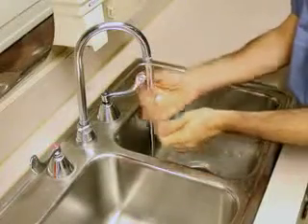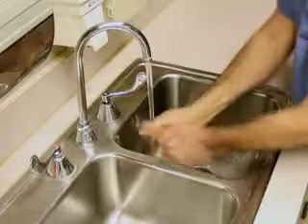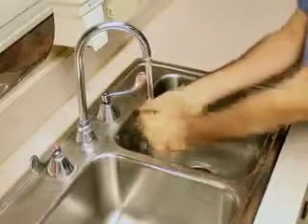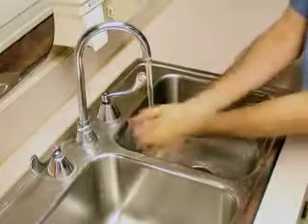It is important to adhere to standard precautions before any contact with patients. Hand washing is the single most effective strategy to prevent the spread of infections.